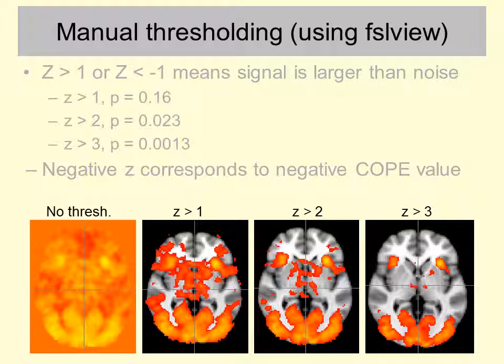Thresholding is just converting that continuum into a binary cutoff where values below a certain point are rejected, thrown away, and values above that point are considered to have passed the threshold. So obviously it's going to be problematic. There's never going to be a perfect threshold value to apply to a continuum. In essence, you're always going to lose some information about the data by doing thresholding.